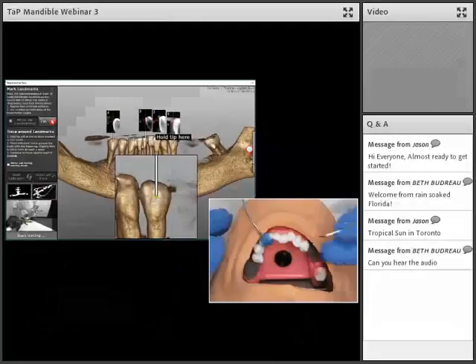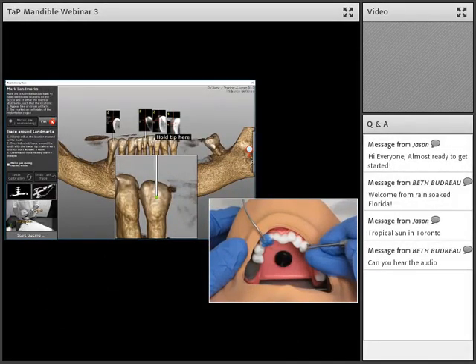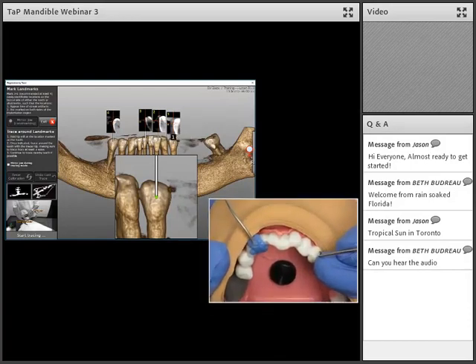And I trace by sliding the ball tip over the surface of the tooth, on at least 3 sides of it: buccal, occlusal, and lingual. As I trace, the points are being collected. 100 points have been recorded for this tooth, so I move over to the next landmark.